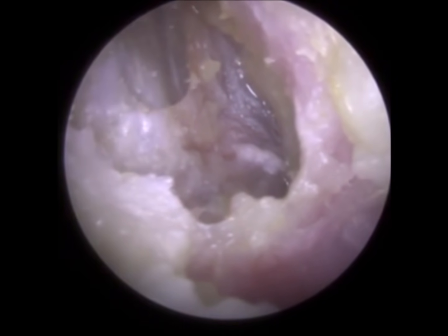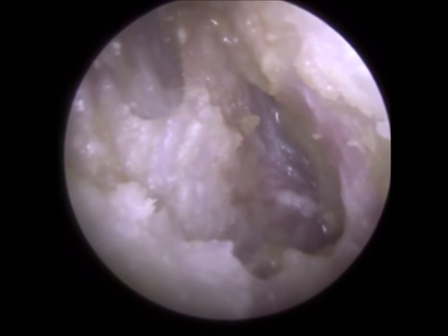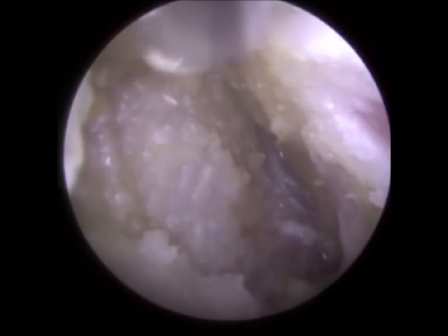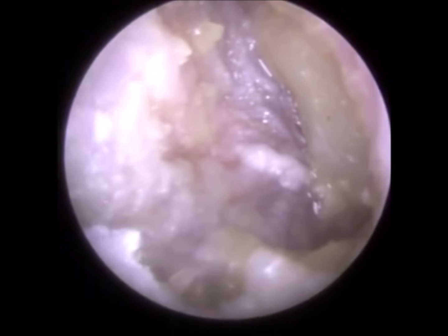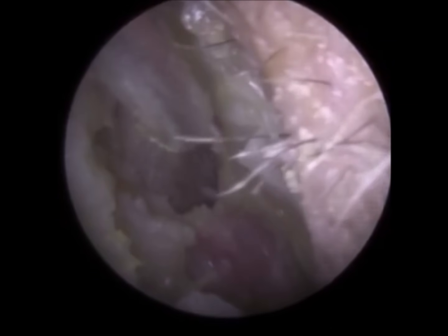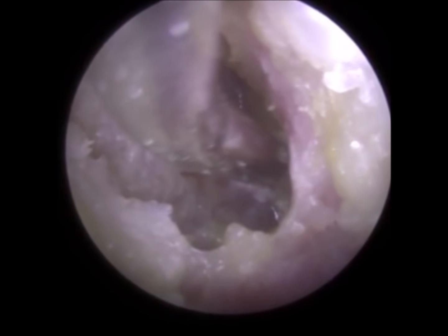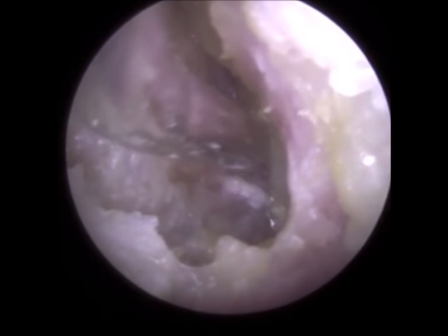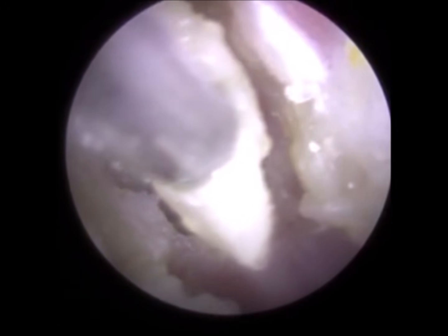He's got one at the base of the ear canal. You can see the lining of the canal wall, where the bits of the ear canal are missing, and where the ear canal almost reconnects. You can see that mark just there. And he's also got 2 very severe erosions to the back of his ear canal, posteriorly. So I've just got the fine end, and I've made a bend so I can get access to the anterior recess to get some of this discharge and dead skin off his eardrum. I managed to do that.